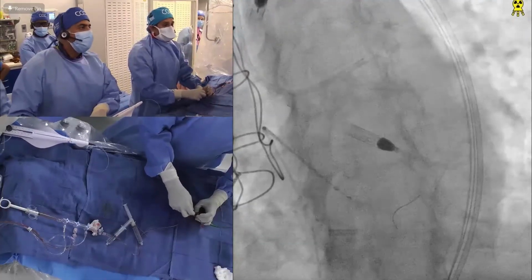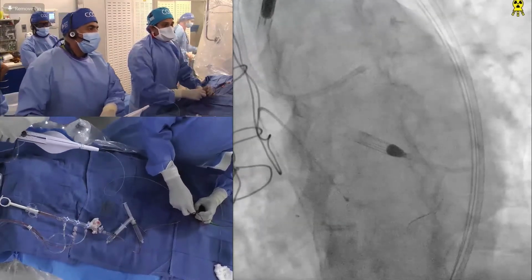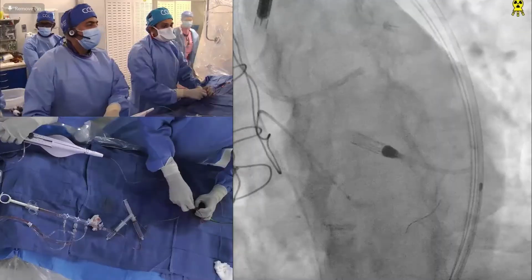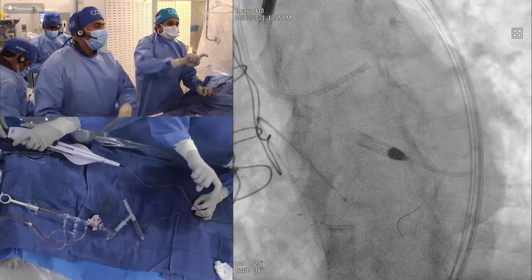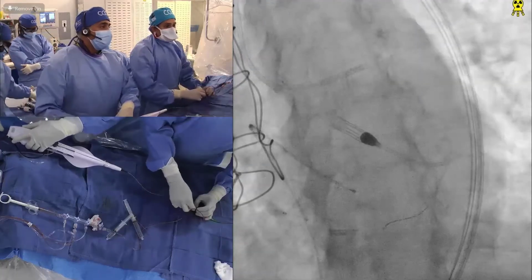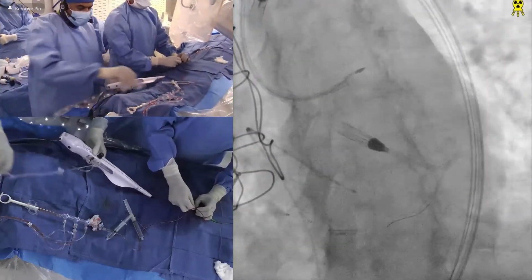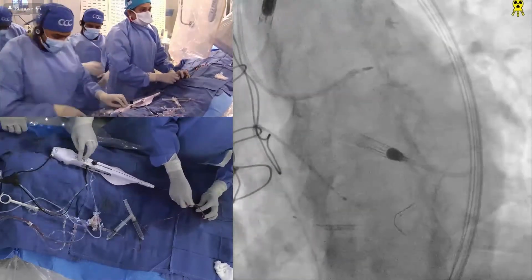If Fielder would not have crossed, what would be the next wire of choice? You know, there are Pilot wires, which you can use because they have a little bit extra tip load, or Miracle wires, which start with a 3 gram, 6 gram. It's all what you're comfortable with. I called for a Miracle only because with a Miracle you are able to make a curve and get into the circumflex. Now the Gaia family, which has come with the Gaia Next, are very good wires, but they come with a pre-made curve and it is not easy to make an extra curve on those wires. And if you make an extra curve, it's not able to navigate well.